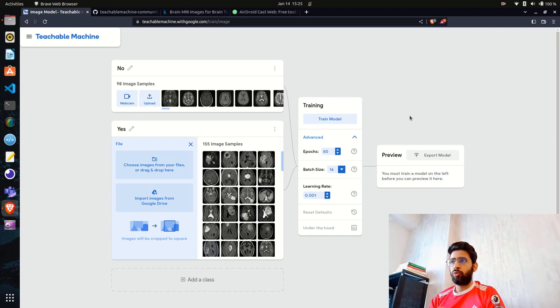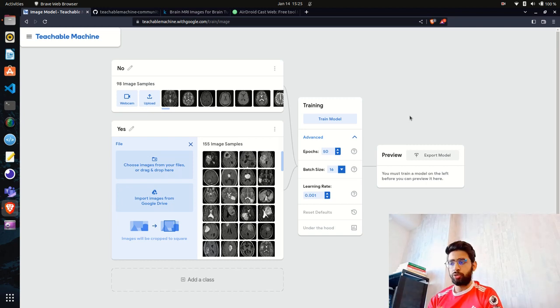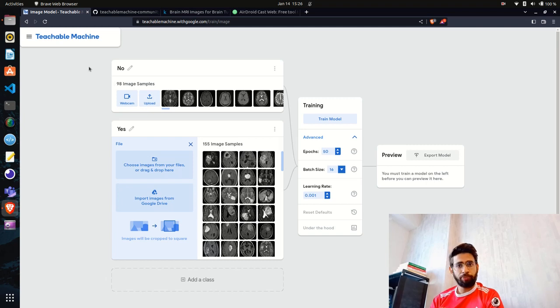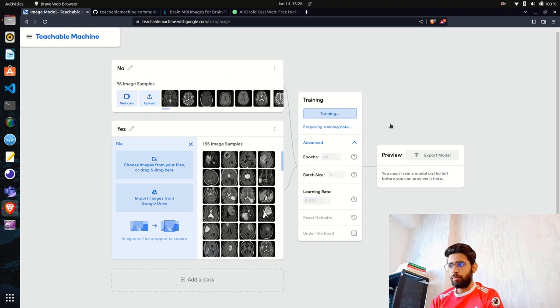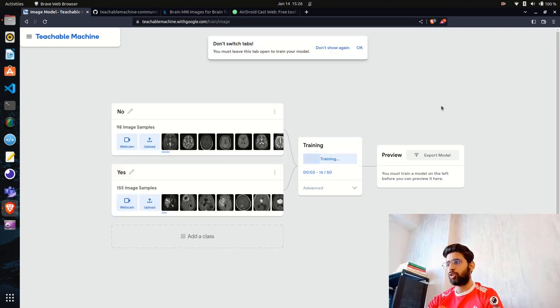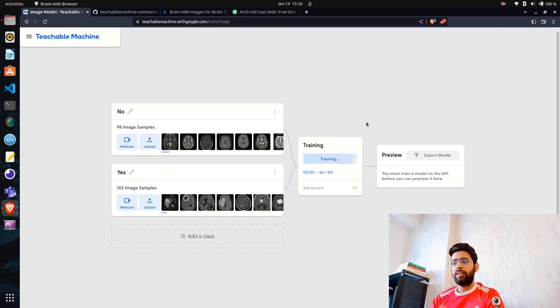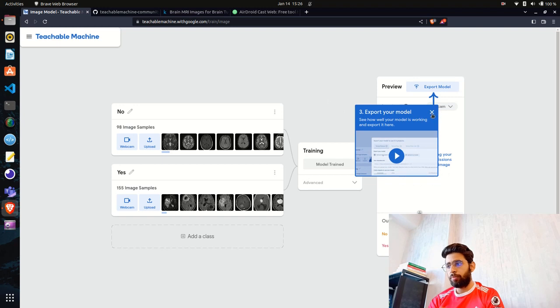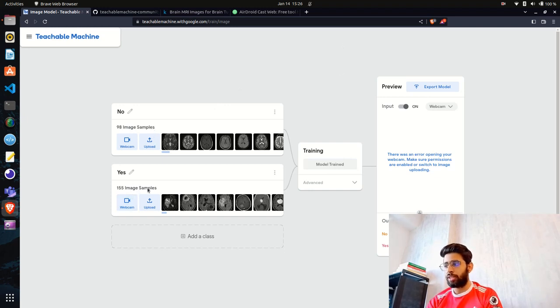You can also use it for things like a waste classifier — plastic, metal, paper, cardboard. If you have no technical expertise, you can use Teachable Machine: upload your data by class and hit 'Train Model.' It says 'Preparing training data' and then starts training. Within a few seconds the model is trained — we had 98 'No' samples and 155 'Yes' samples.